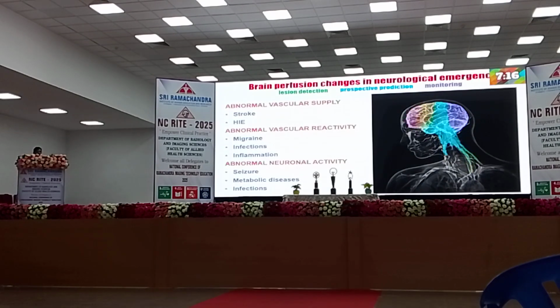Right. Next, ASL is very useful in stroke patients, HIE, migraine, infection and inflammation, seizure, and metabolic disorders. We will see them one by one.